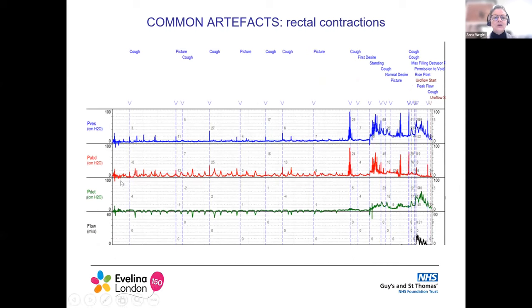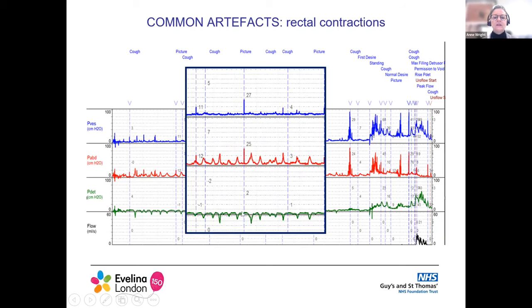This is a common artifact — this was actually in a neurogenic case — repetitive phasic contractions in the abdominal line which aren't present in the vesicle line, representing rectal contractions. When you look more closely, you see a negative deflection in your P-DET line. Sometimes when you get intermittent rectal contractions with slightly higher baseline pressures, you can misinterpret these as detrusor overactivity in your detrusor line.